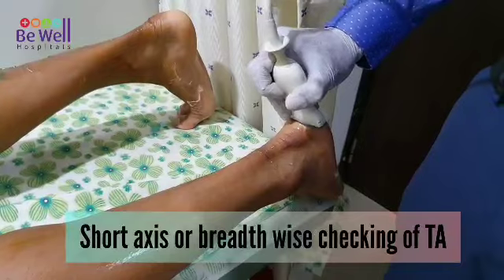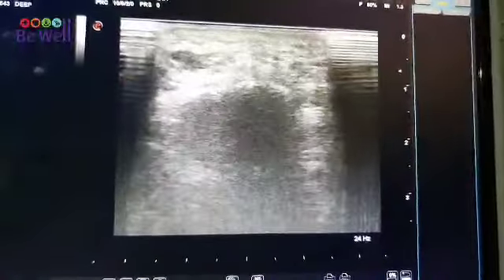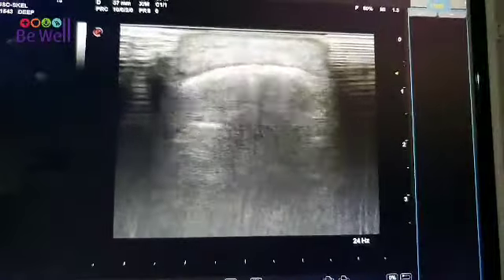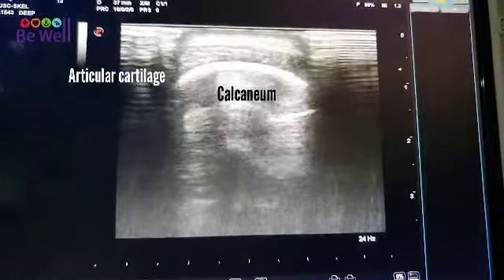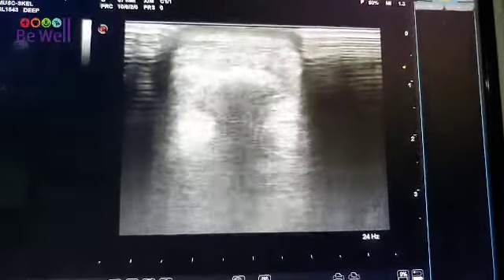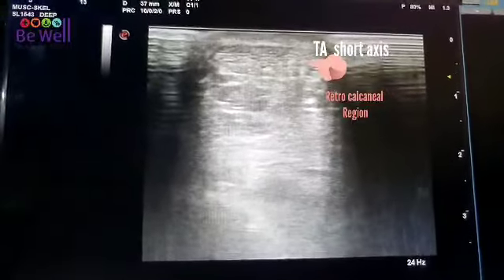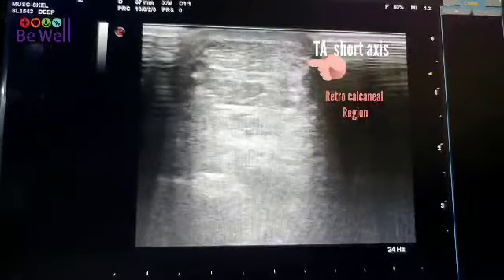So now checking the tendo Achilles in the short axis. If you see, the dark structure is the calcaneum. From here, you can see the encapsulated structure on top is the tendo Achilles, right close to the skin. See the consistency — nice, bright, hyperechoic structure.